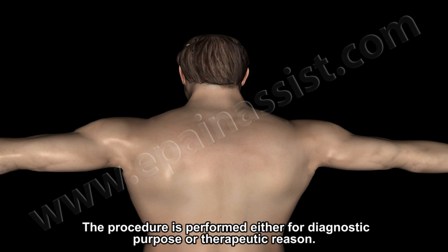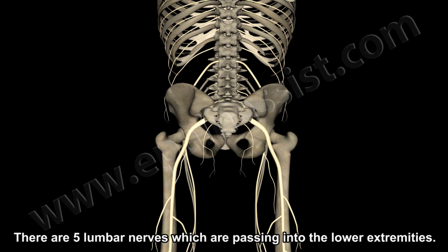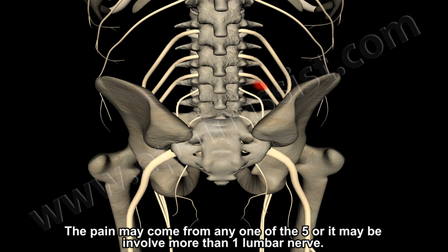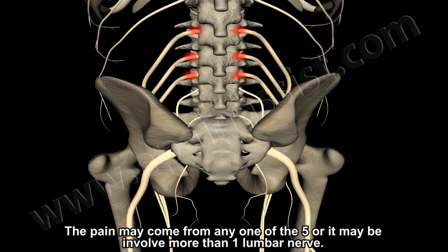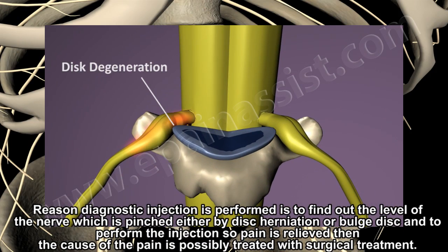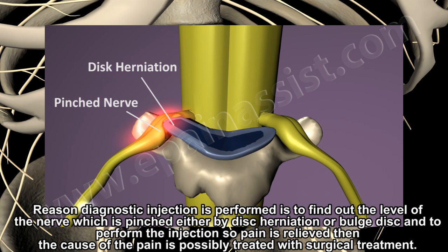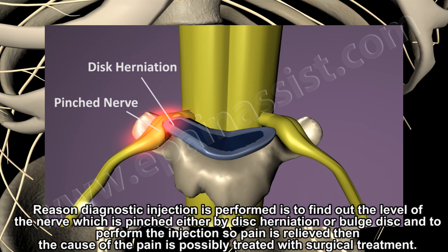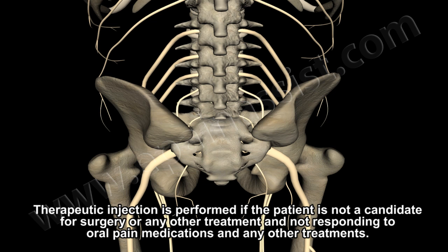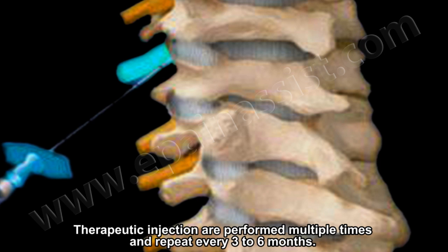The procedure is performed either for diagnostic purposes or therapeutic reasons. Diagnostic injection is performed to evaluate the cause of the pain. There are five lumbar nerves passing into the lower extremities, and the pain may come from any one or more of them. Diagnostic injection identifies which pinched nerve — caused by disc herniation or bulge disc — may be treated surgically. Therapeutic injection is performed if the patient is not a candidate for surgery or is not responding to oral pain medications. Therapeutic injections are performed multiple times, repeated every three to six months.